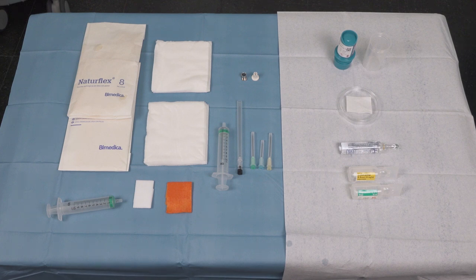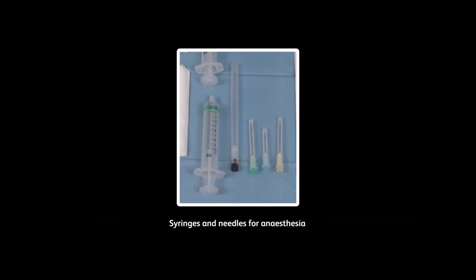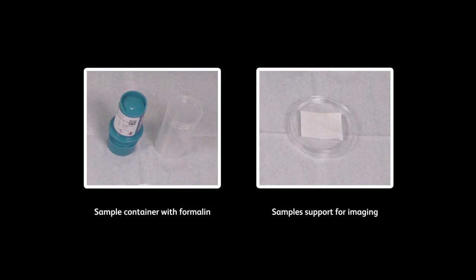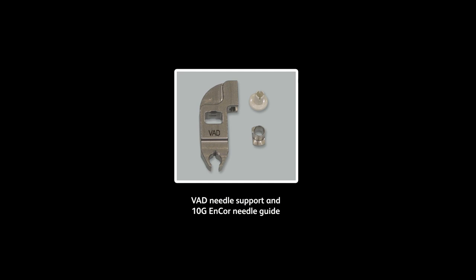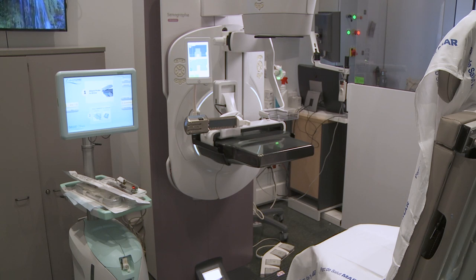All materials needed for the exam must be prepared in advance. Pristina Serena is set up for a horizontal approach, and the Encore Inspire is ready for probe attachment.